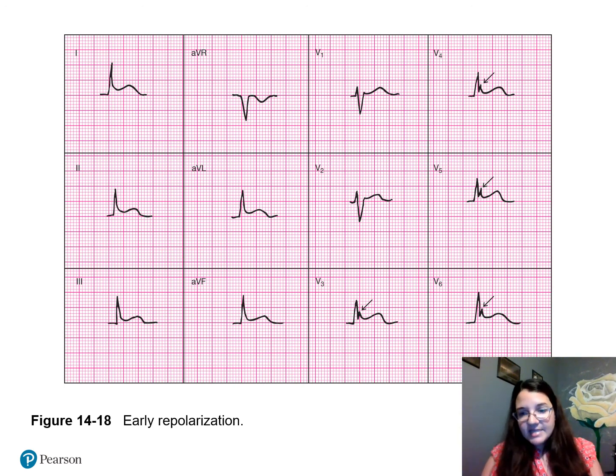So what are my signs of a heart attack, of a STEMI and a non-STEMI? ST elevation or depression, and also a very wide Q. In this case, my Q is coming after the R, right? And it's on top of it. So do you see any ST elevation here? No, because it is on top of my QRS. It looks like a fish hook, early repolarization.